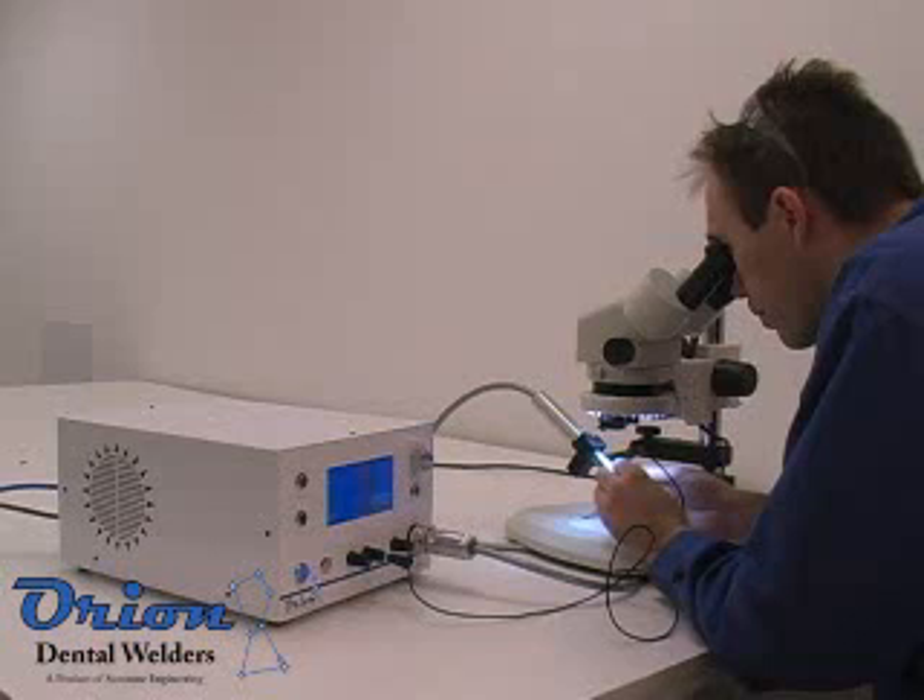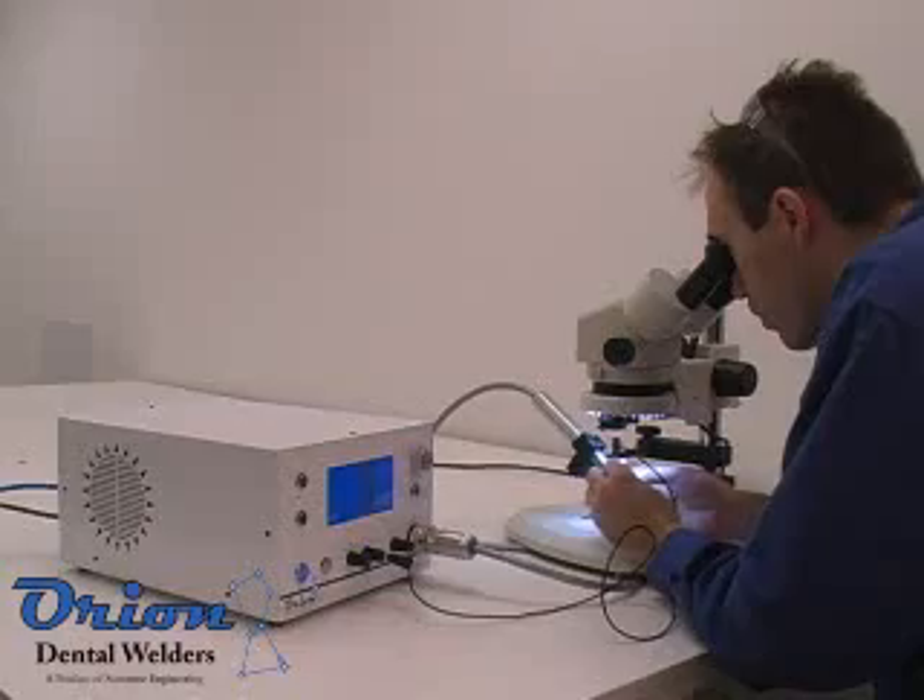The Orion Stereo Microscope uses a shutter system to provide optical clarity before welding and full protection during the welding arc. The Orion's computer ensures that the shutter is closed before allowing the weld to take place.